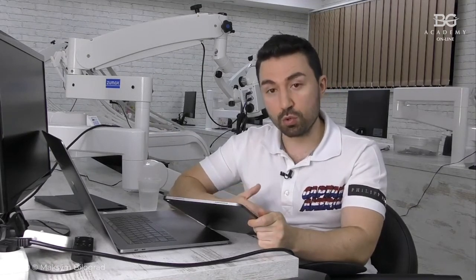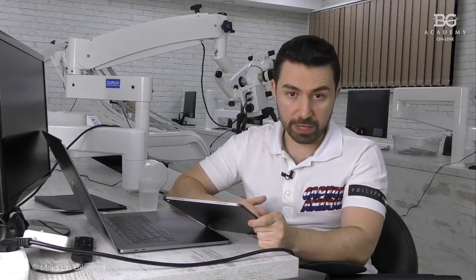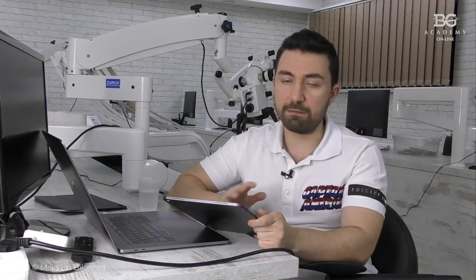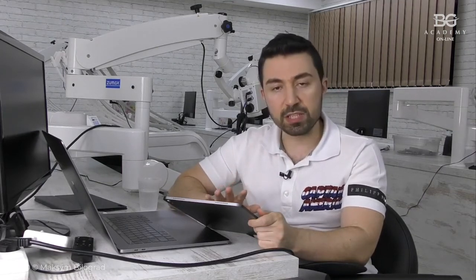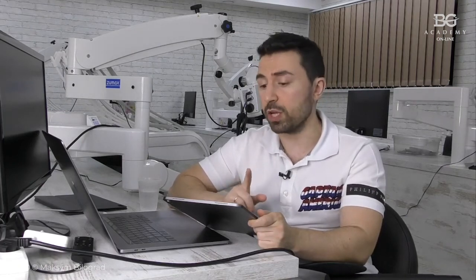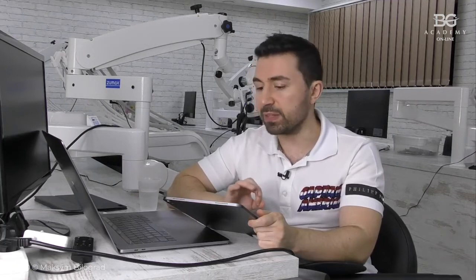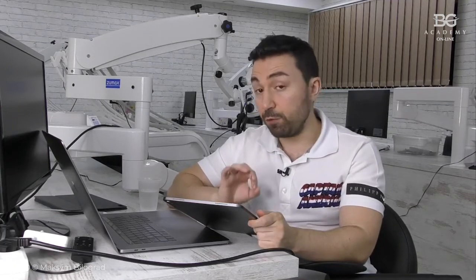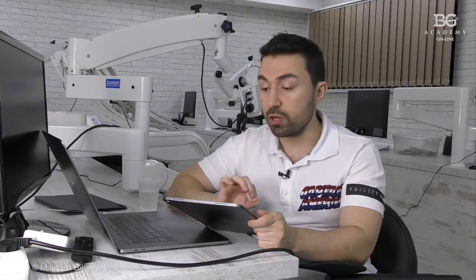So you have to be sure the veneer fits before you place the rubber dam. So you do a try-in. If they fit, if there is no space, perfect. Then you do the rubber dam isolation. And if you have a tight interproximal contact, you have to put a wedge. I was explaining this. You have to put a wedge. This is really mandatory.